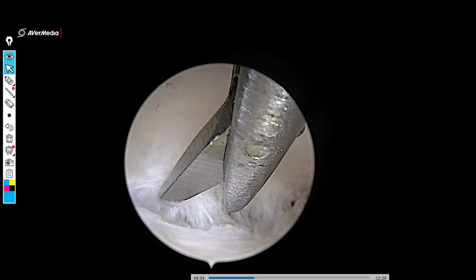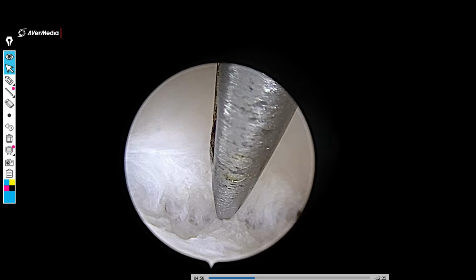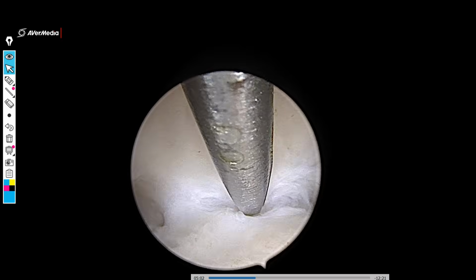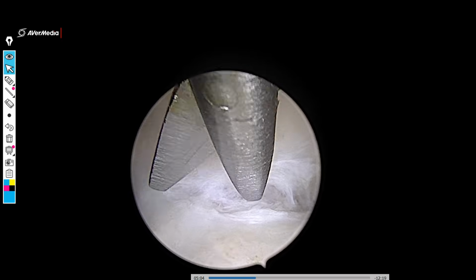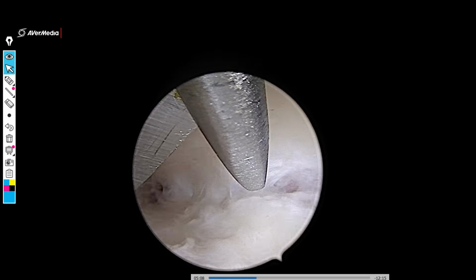Here it is important that a good hysteromat be used. We are using a hysteromat from Allen company. They have a new hysteromat with a continuous flow as compared to a pulsatile flow, which is there in most of the other Indian companies. So I find that very, very useful.